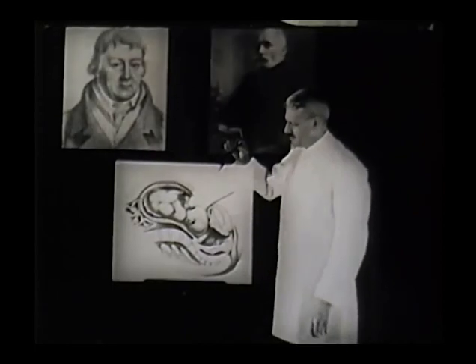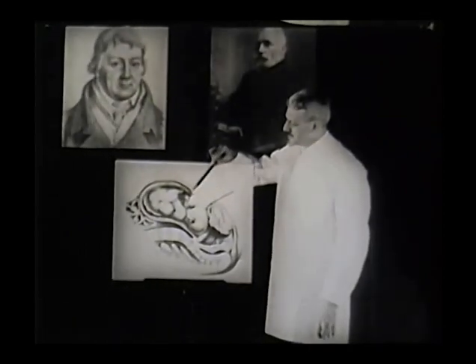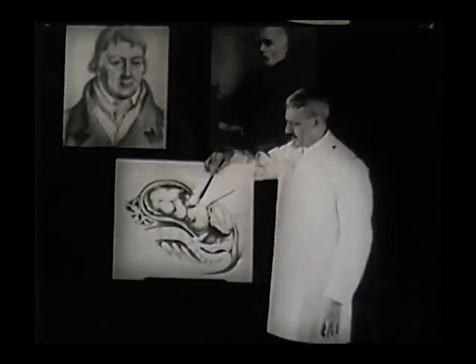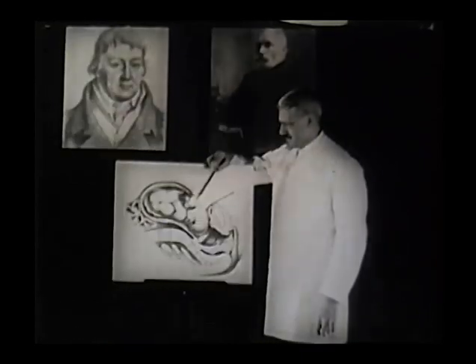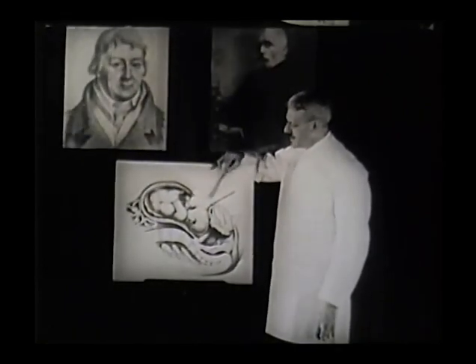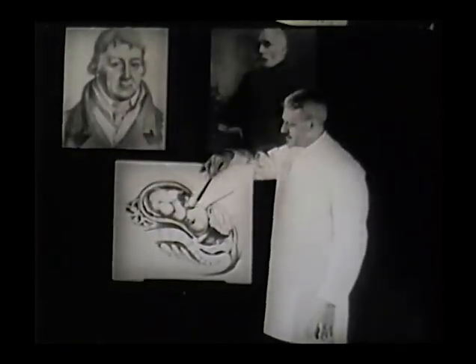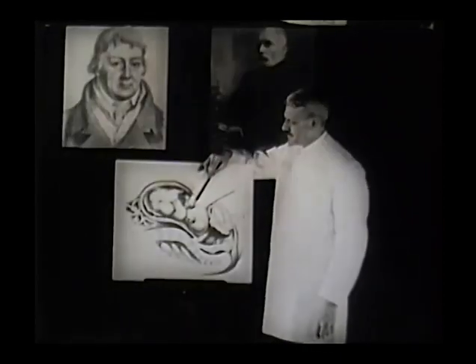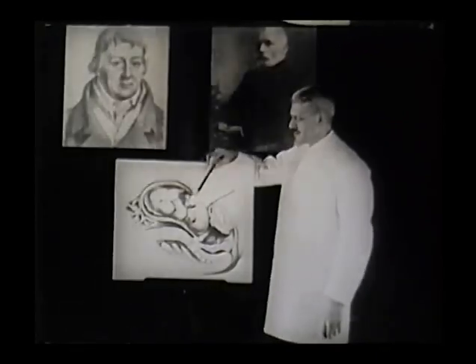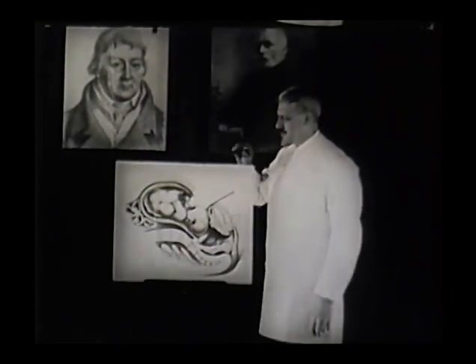There are two kinds of low cervical cesarean. One where the incision being made just above the pubis, approach to the lower uterine segment is gained by cutting through the peritoneal cavity. It is called the intraperitoneal method. The other kind is where the incision is made just above the pubis and the peritoneum is pushed upward towards the navel off of the bladder, and the bladder is pushed to the side and an area of lower uterine segment exposed sufficiently large for the delivery of the baby. This is called the extraperitoneal method, the general peritoneal cavity not being open. The majority of men prefer the direct route, the intraperitoneal method.